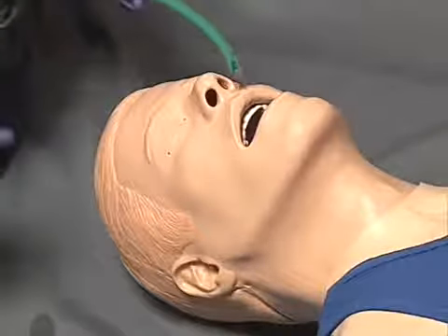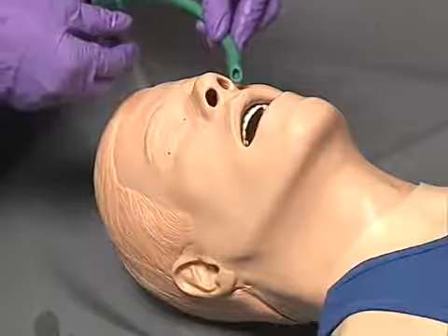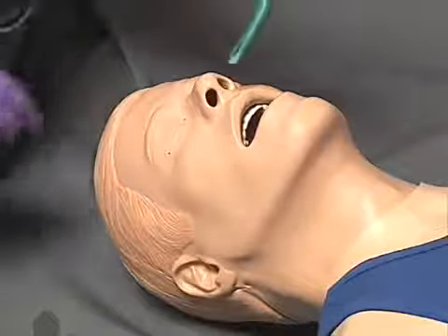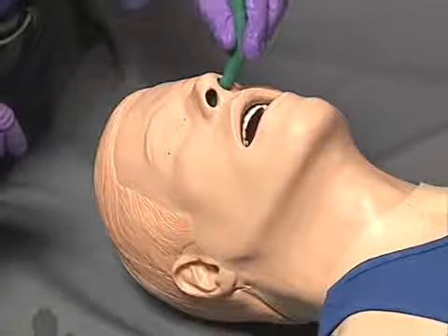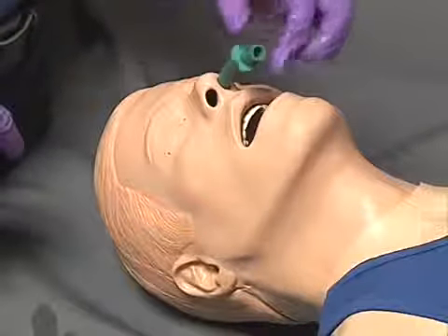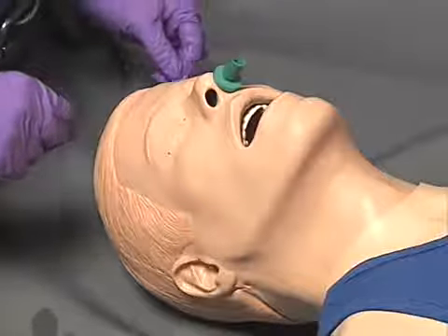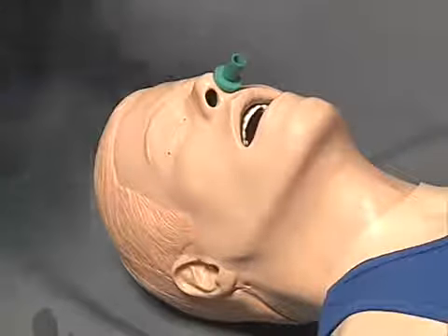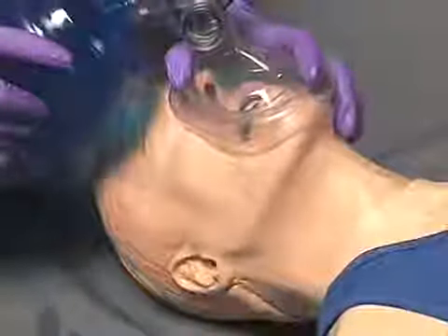If inserting the nasal airway into the patient's left nare, it is necessary to invert the airway so the bevel of the airway remains along the septum. Once the nasal airway reaches the nasopharynx, rotate the airway 180 degrees to resume alignment with the normal anatomical curvature of the nasopharynx. Continue to insert the nasal airway into the oropharynx. Once the nasal airway is in place, the last step is to check for adequate air exchange.